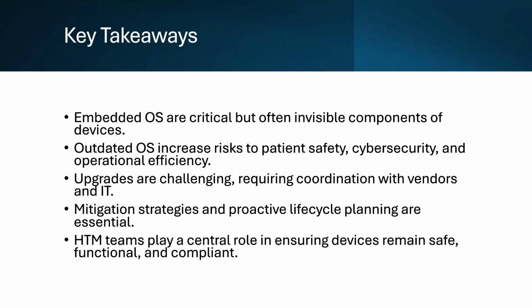Upgrades are challenging, requiring coordination with vendors and IT. You can't just update a medical device operating system like you would a laptop. It requires planning, validation, and collaboration. Mitigation strategies and proactive lifecycle planning are essential. Even when you can't immediately fix the problem, you can reduce the risk through network segmentation, access controls, monitoring, and planning for eventual replacement. HTM teams play a central role in ensuring devices remain safe, functional, and compliant.